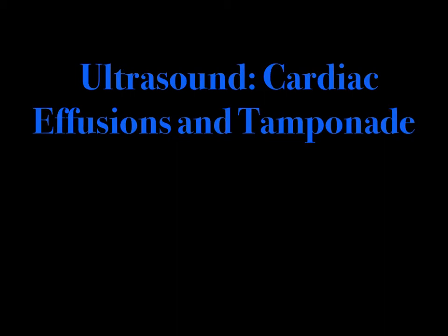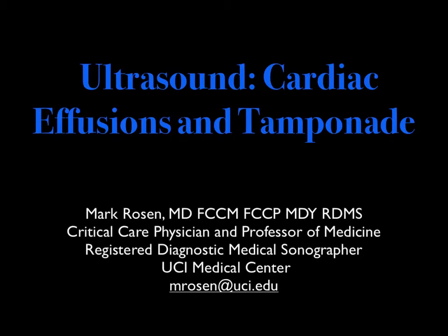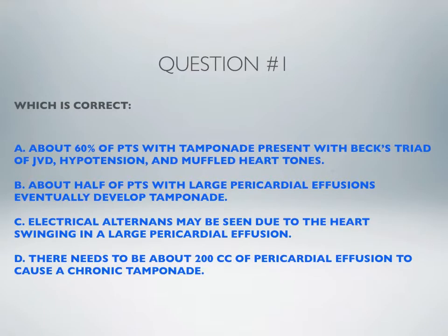Hello, this is Dr. Mark Rosen, and today we're going to be talking about cardiac effusions and tamponade, specifically how it relates to ultrasonography in the intensive care unit and the emergency department. We'll start off with two questions.